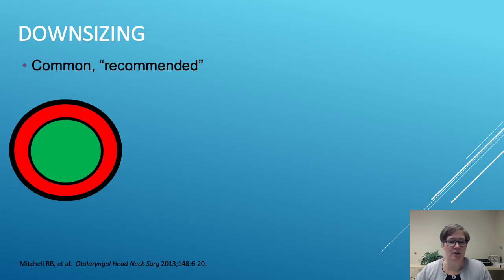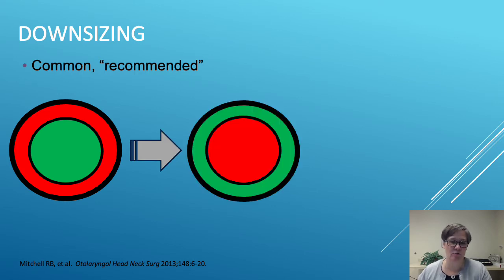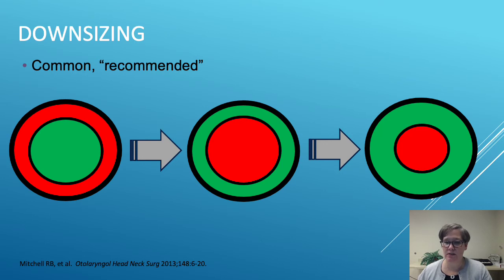If the steps to decannulation are moving along, especially after laryngoscopy, then trach tube downsizing is recommended and commonly used. It's all about plumbing, shifting from initially caring about the air within the column, shown here in green, to a shifting importance on the airspace outside the trach tube within the trachea. And as we downsize, we increase that tracheoluminal air, making more available for the patient. So here's a case that highlights this concept of tube versus tracheal diameter.